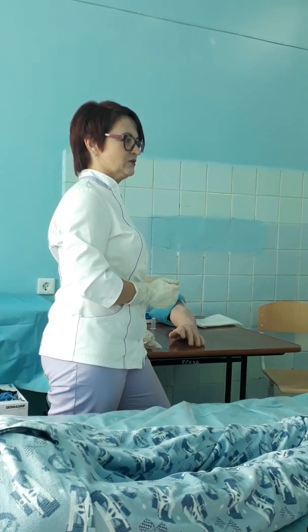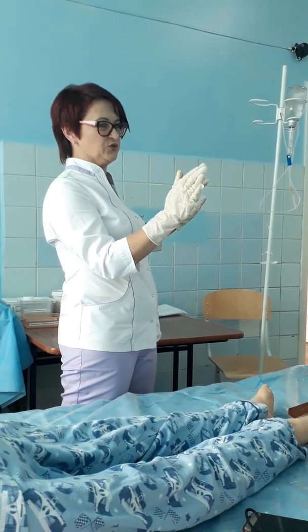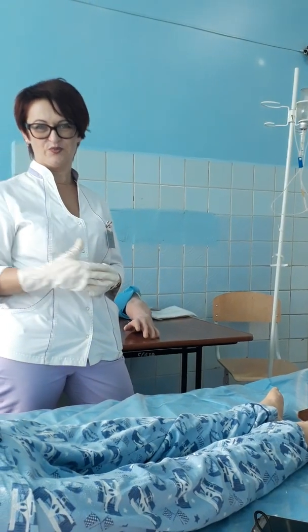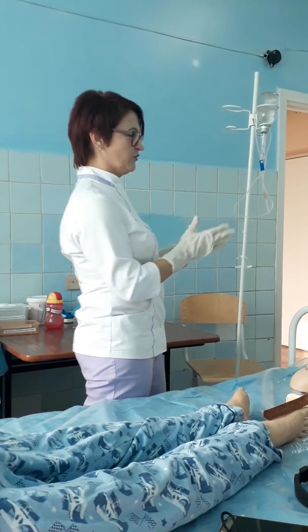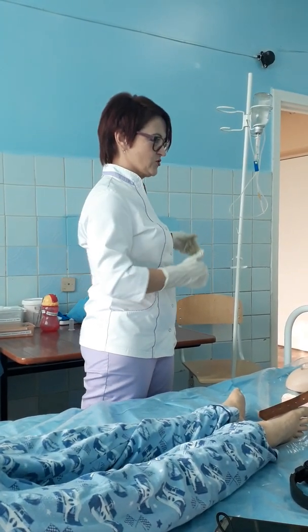Knock, knock, knock. Even if the door may be open, your patient must give you permission. Ask, may I come in? How are you? And make sure that it's your patient.